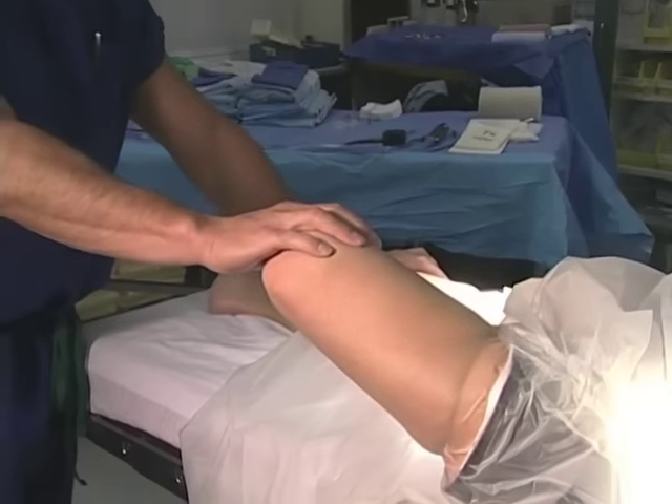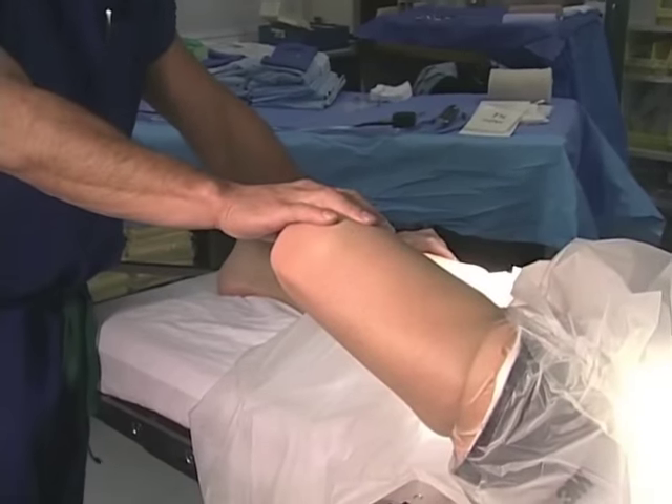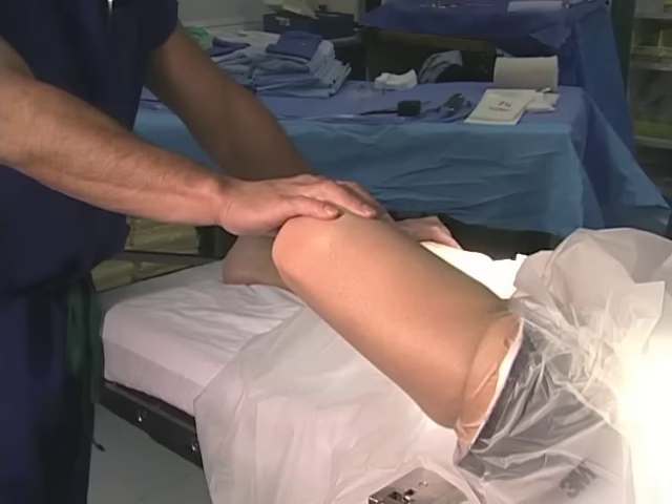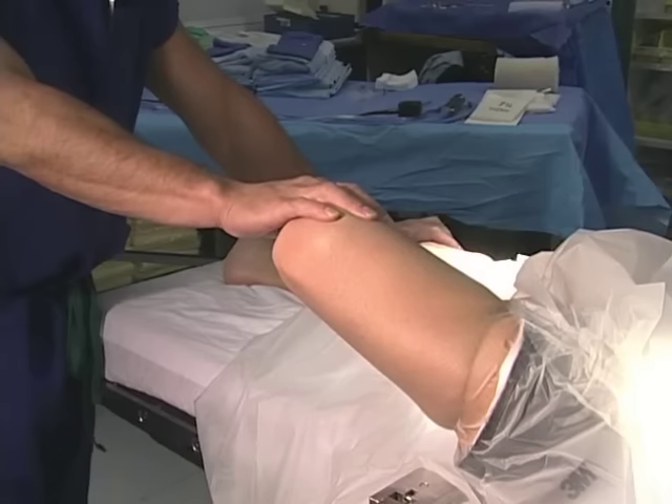Pushing the knee to the floor allows the hip to externally rotate, which imparts a varus force, allowing for lateral compartment opening and arthroscopy.